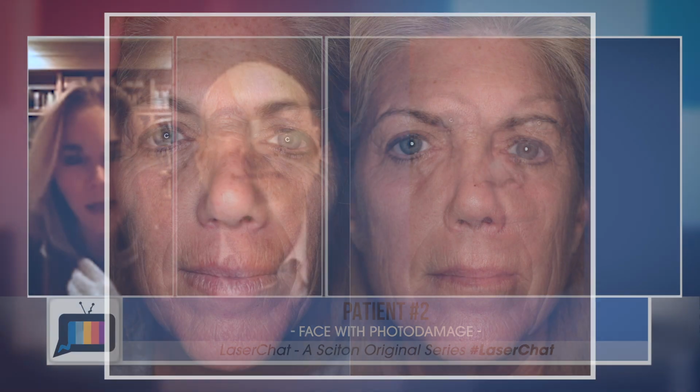Tell the patient she'll probably have about 5 days where she can't wear makeup, 5 to 7 potentially, and usually by 7 they're all in makeup, but that's a reasonable recovery for these patients. And I'm sure that you're going to show me unbelievable after pictures, because these are the type of patients that usually do exceptionally well.